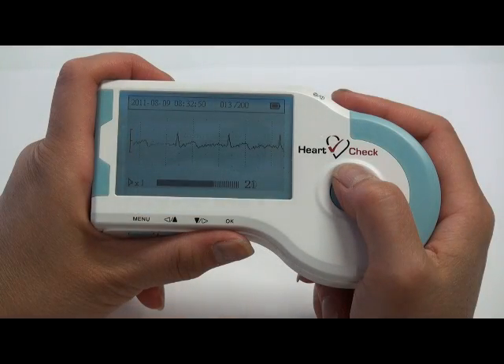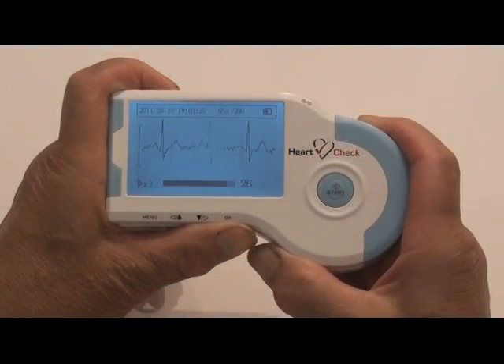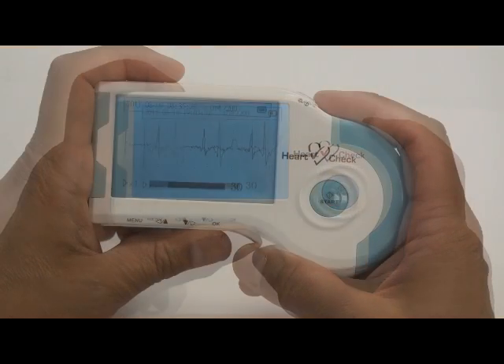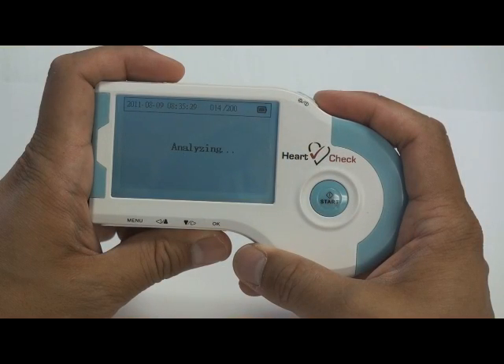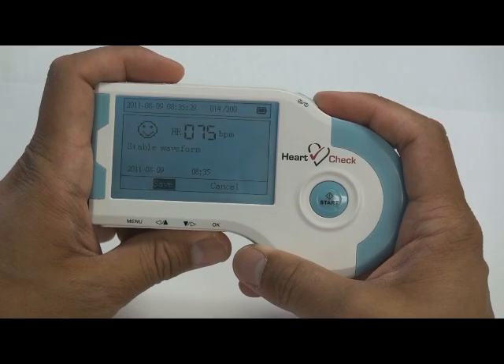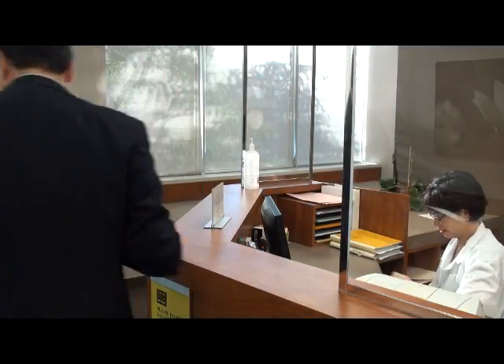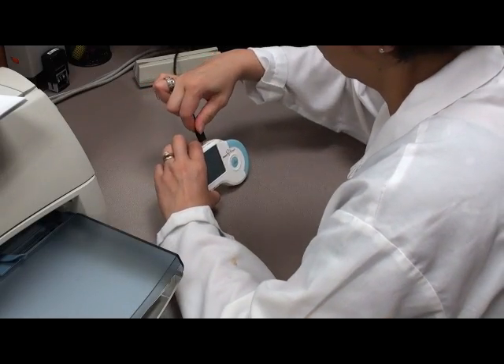The device can store up to 200 evaluations for further review and analysis by a medical professional. The HeartCheck ECG monitor is easy to operate and can be used anywhere by everyone. This device can be used to aid doctors to quickly monitor and discover heart disease, arrhythmias, atrial fibrillation, and many other medical conditions associated with the heart.